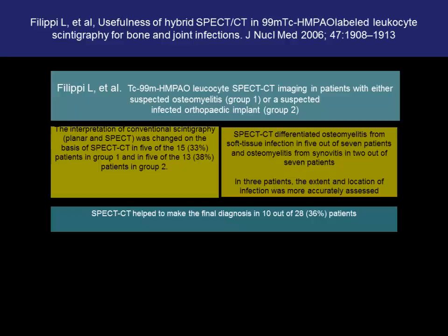and again it's the same thing. They come as SPECT-CT help to make final diagnosis in about a third of patients accurately. In about 36% of the group, SPECT-CT will help to make a definitive diagnosis, to delineate, and also to assess the extent of pathology.